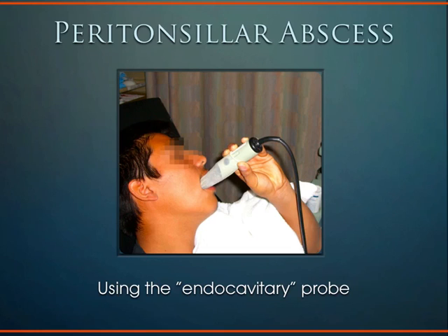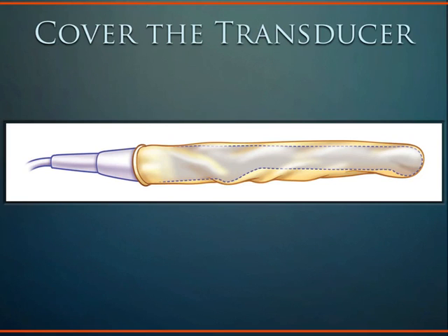So usually I give them a little medication to sort of make them feel sleepy, like midazolam. So after a little midaz, and you can give that intranasally, actually, so it's pretty easy to give, you want to cover the transducer with a sheath. Just as you would do when you perform endovaginal ultrasound, you put a sheath over the transducer, put some gel. What's not pictured here is gel in between the probe and the transducer sheath, because you don't want to have any air up here, okay?